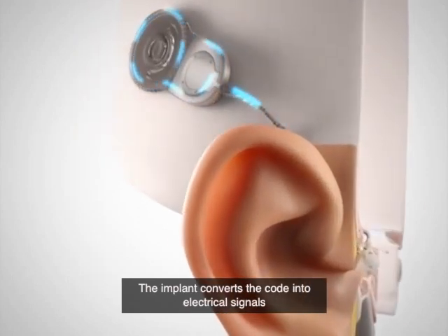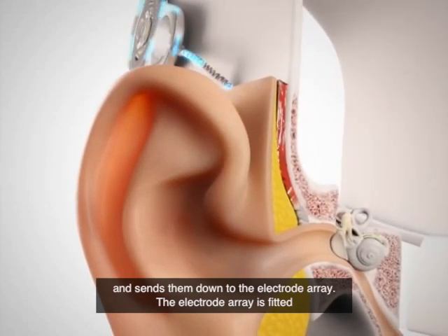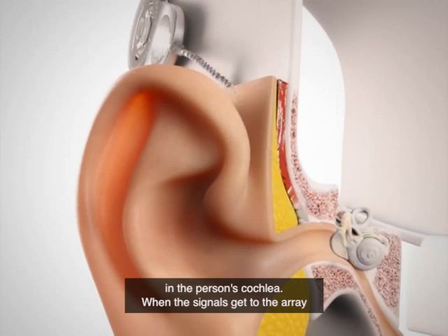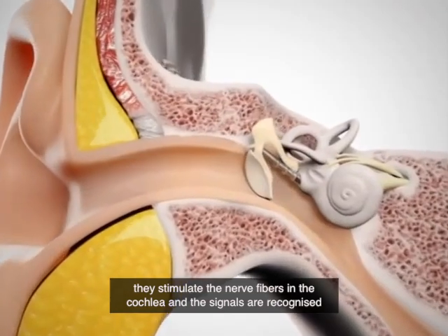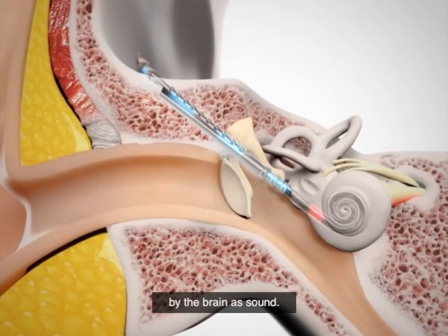The implant converts the code into electrical signals and sends them down to the electrode array. The electrode array is fitted in the person's cochlea. When the signals get to the array, they stimulate the nerve fibres in the cochlea and the signals are recognised by the brain as sound.